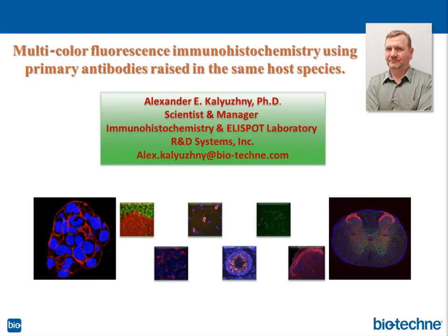And Amir asks, would you dismiss any sequential staining protocol with primary antibodies of the same host? So that is first primary, first secondary, wash, second primary, second secondary, and so on. Unfortunately, there's a high risk of cross-reactivity of irrelevant secondary antibodies to irrelevant primary antibodies.